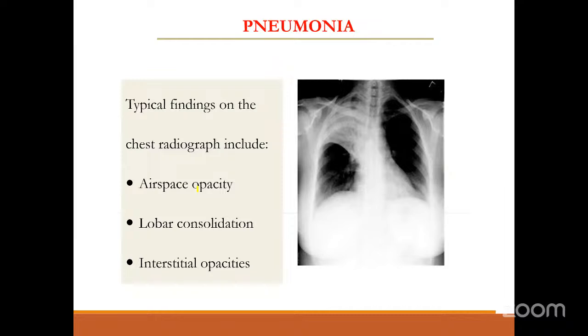So typical findings or routine common causes that we look for are pneumonia. So why should a pharmacist know about pneumonia? Here is where you also take a call. If you have a patient who comes with a diagnosis of pneumonia, you have an X-ray or a CT. But for those patients on ongoing care in the ICU, when antibiotics are being escalated or changed, you should also know where the criteria for VAP come in.